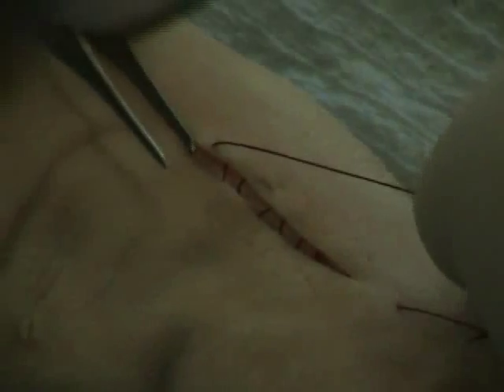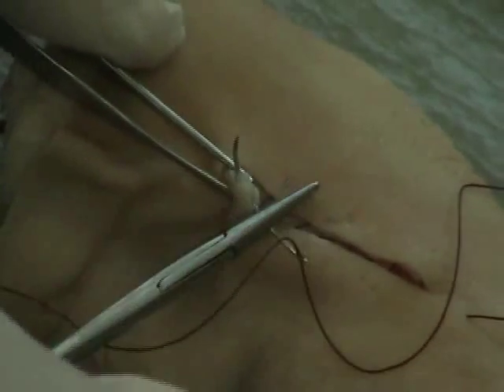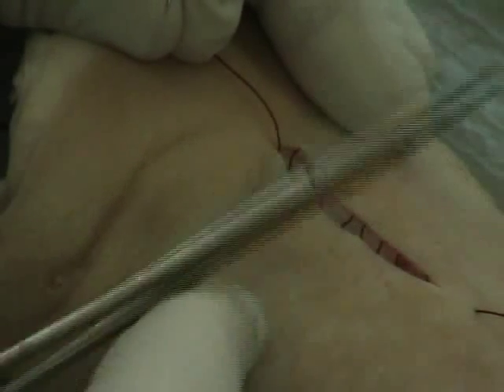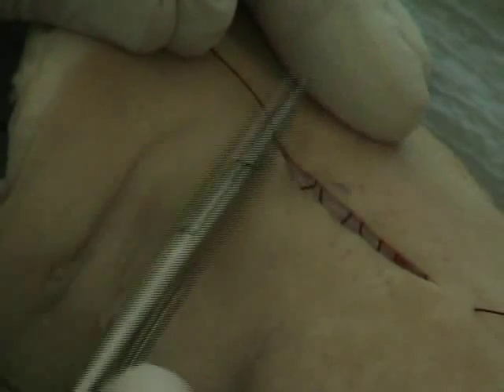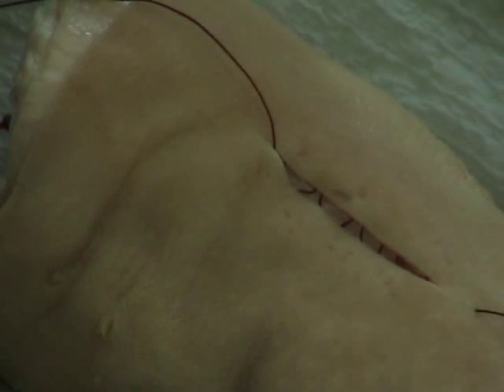As we get close to the end, notice the threads going parallel to each other and crossing like such. You don't want the threads going at an angle back and forth — if you take too big a bite or reach ahead, it comes back forward. When you pull it together, you'll have places that are very close together and places that are very wide, and where it's wide, it's going to tend to buckle and turn inward, which you don't want.